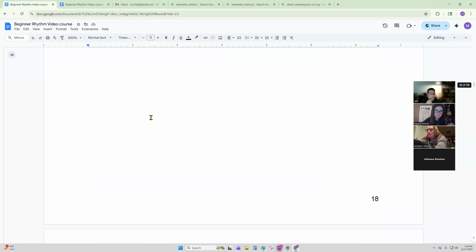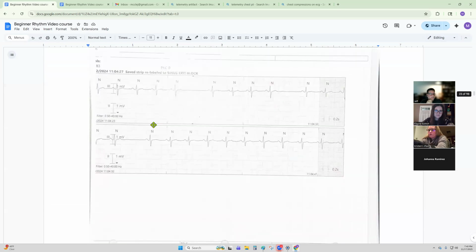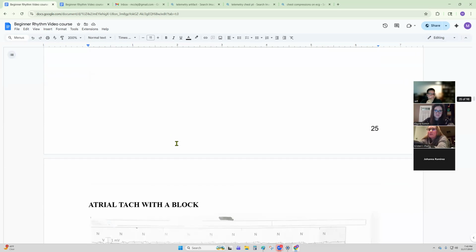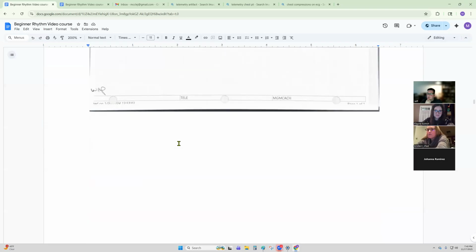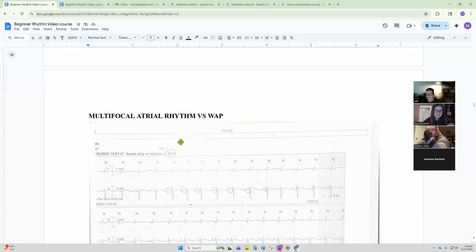I wish I had little slides that I could just click on. Yeah, I know. And you need calipers. Where are your manual calipers? Well, you couldn't hold them up to the thing anyways. Wait, where is it? Right there.